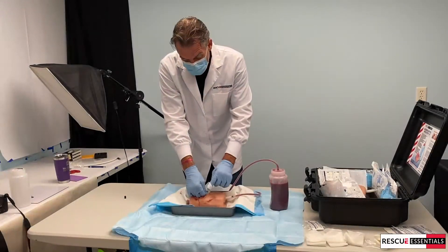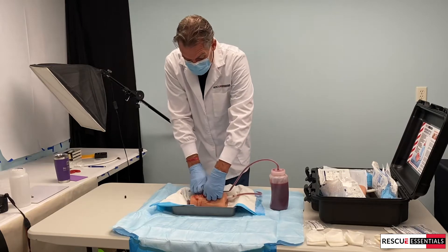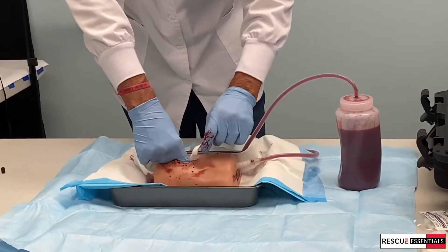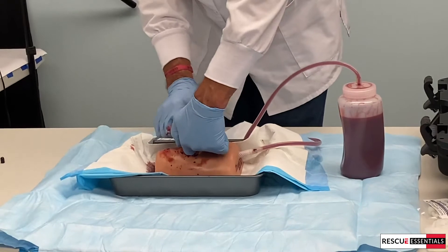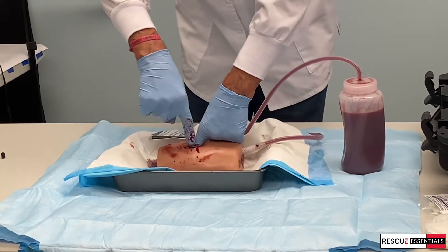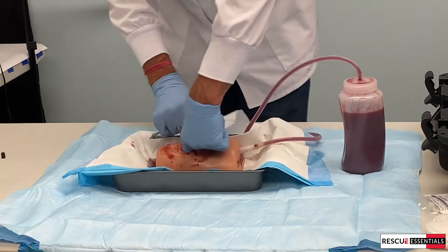You'll see a lot of wound packers want to put a little circle on and push that down in there. The key is to continually hold pressure. I want to push that in before I pull this one out. Push that in and I'm going around the world, circumferentially around this wound cavity, trying to pack to all parts of it.